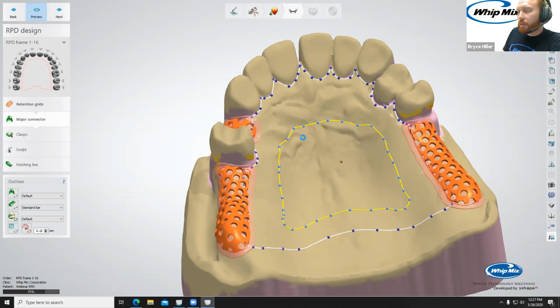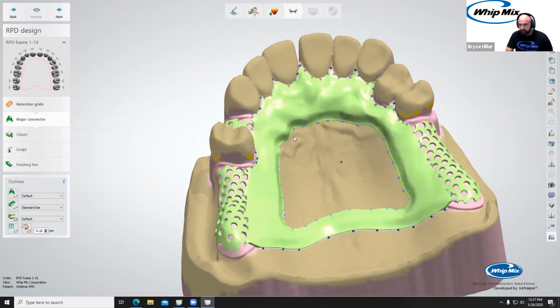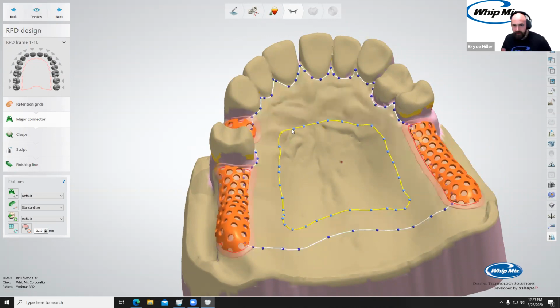Imagine drinking coffee. Something I've heard is a main reason people like to have the windows is that you can actually feel the temperature of whatever you're drinking. Something else that will help is that you actually get to feel your true rugae and gingiva, so it should give a little bit more sense of feeling as well. Yeah, I would imagine there's a pretty serious comfort factor in there.